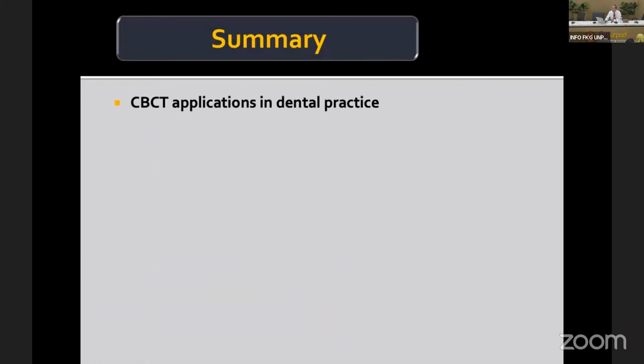Now, in summary, the CBCT has been widely used in our practice: diagnosis, implant, and also sleep apnea surgery. So pretty much every field is using the cone beam CT now.